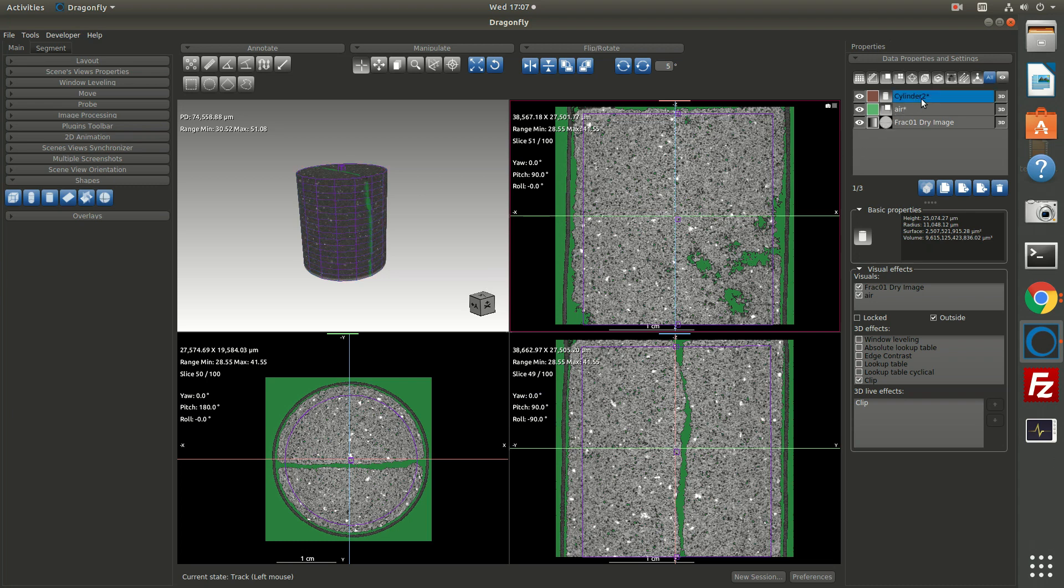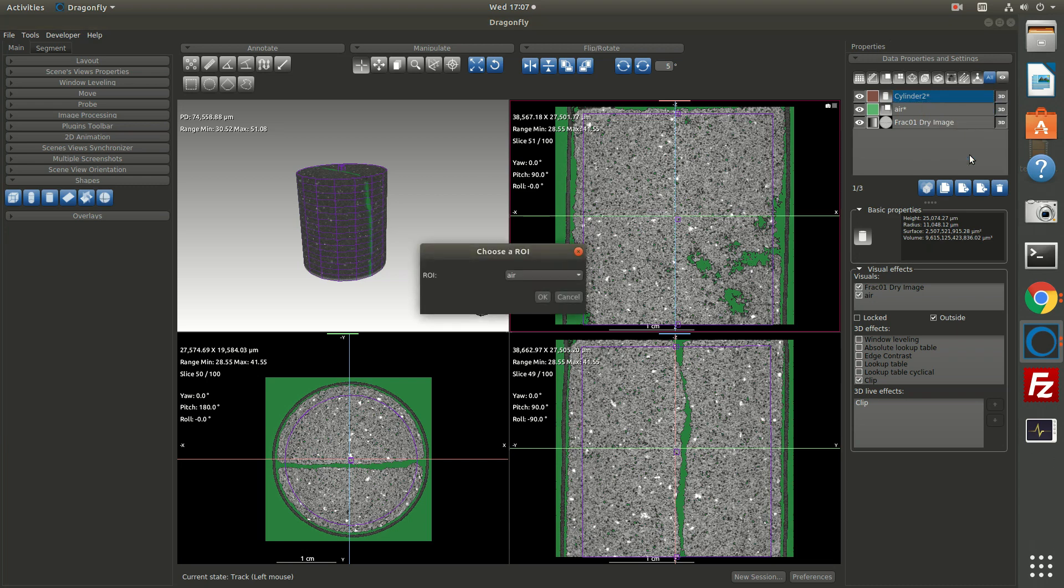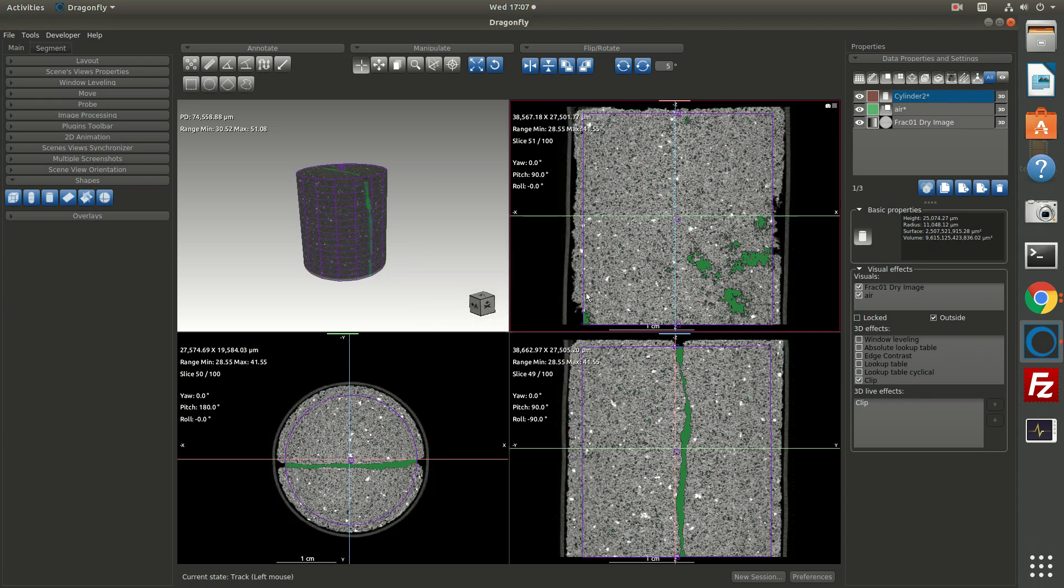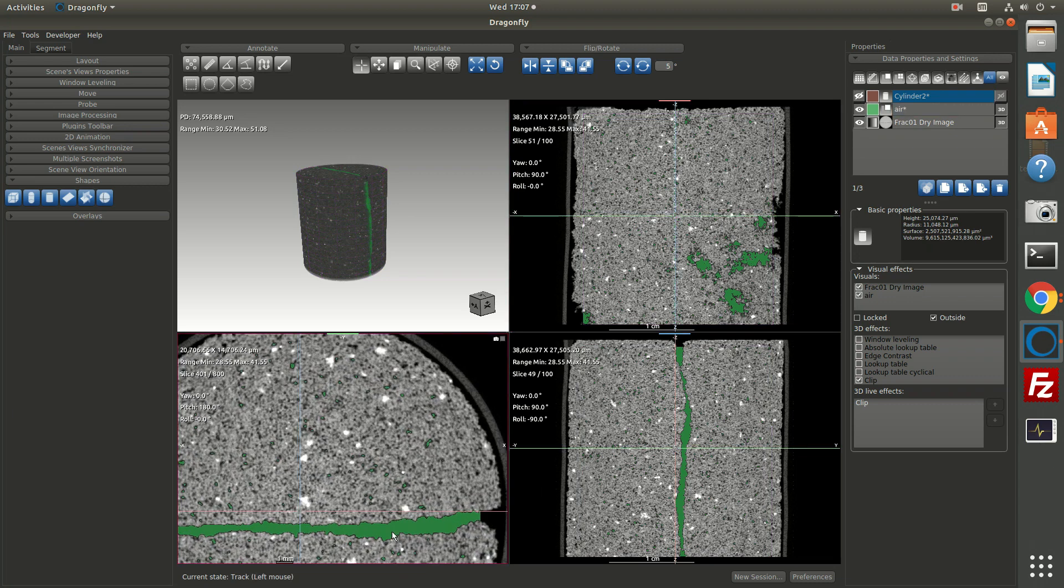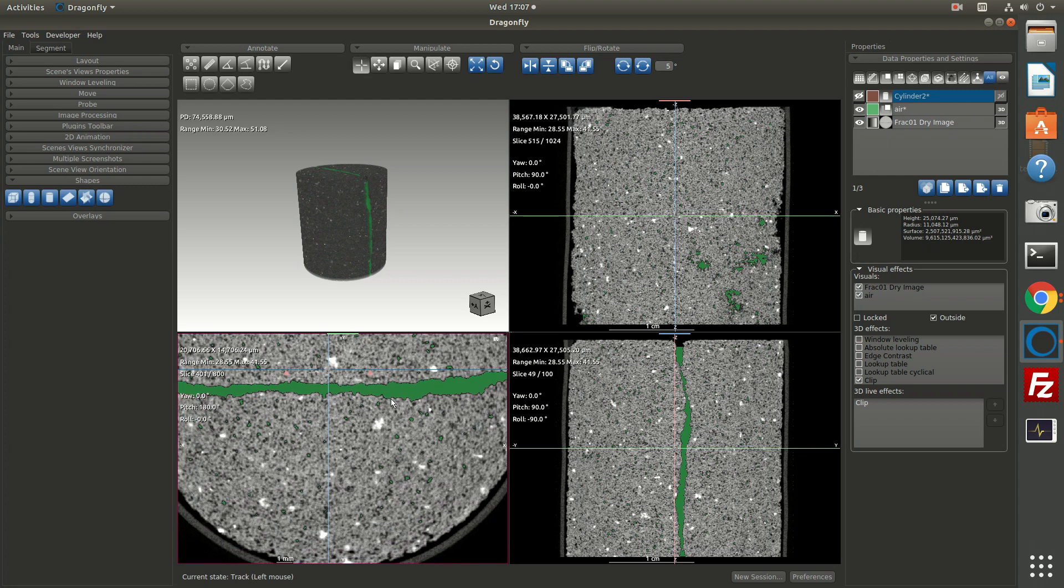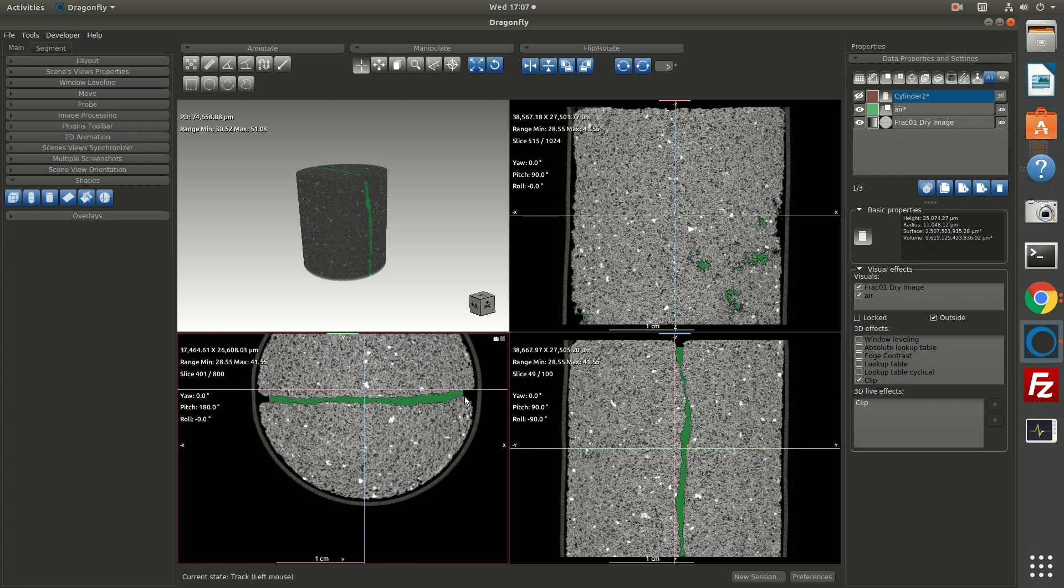So we have our cylinder. And what I can do is I can right click on the cylinder and say I'd like to use this cylinder to mask an ROI. So when I choose mask ROI, it asks which ROI to mask and I choose air. Now everything outside the cylinder is removed. And so I'll turn off the cylinder. So you see now that we have an ROI of air and it includes all of the pixels inside the fracture plus some of the larger pores that were identified by thresholding. But it now excludes everything outside the cylinder.